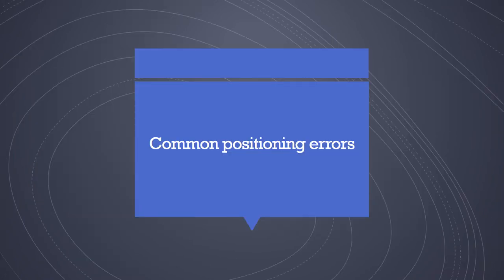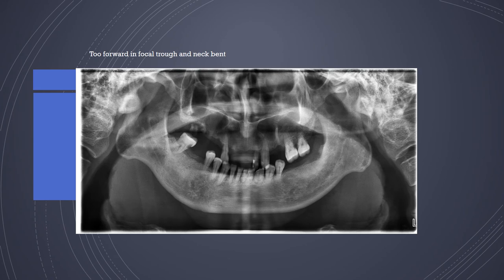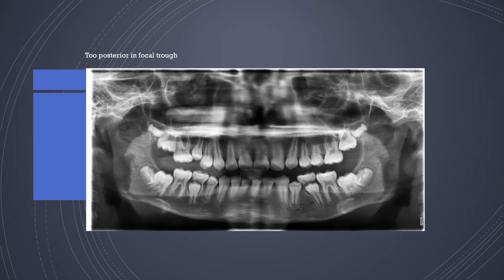Now let us look at some common positioning errors. If the patient is placed too far forward in the focal trough with the neck bent, you get an exaggerated smile line and the gonial angles pop out. If the patient is positioned too far posteriorly, you get flattened, widened teeth in the center and a flattened smile line, with the central area blurred because it is out of focus and not in the focal trough.